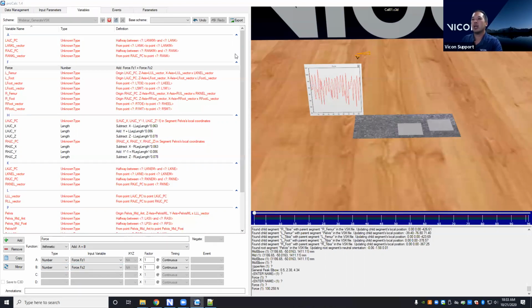Okay, so just that. Does ProCalc help to solve the gimbal lock problem? Unfortunately not. The only thing that you can do is change your rotation orders. So if you have an idea of where you might have a problem, you could go ahead and change your rotation order in that way.